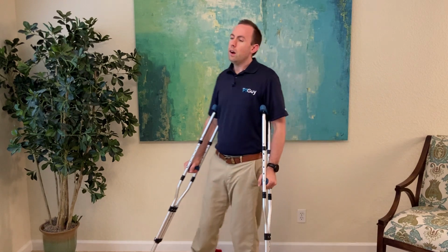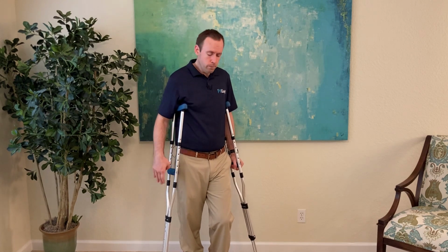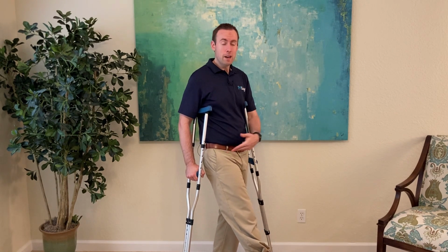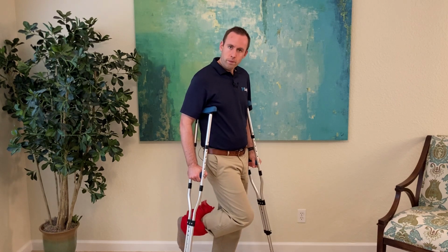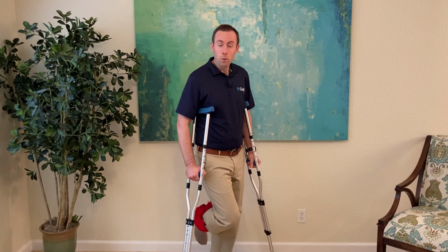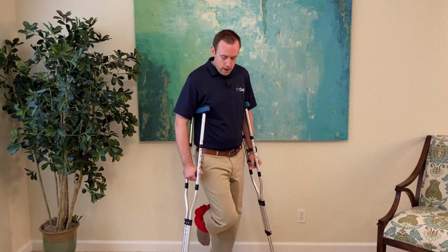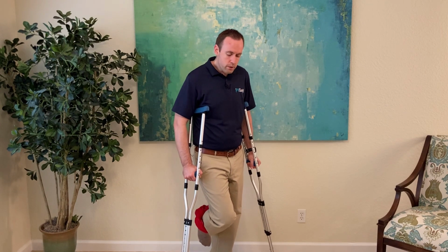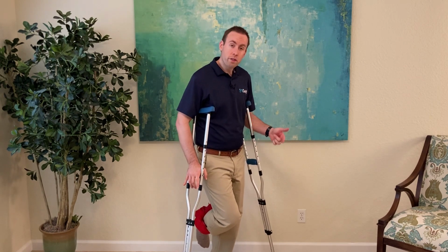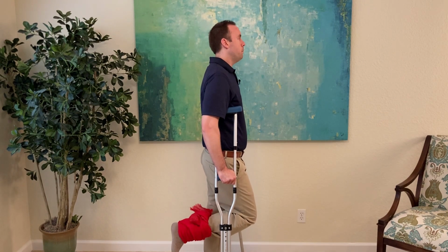If you don't have that issue and you can bend the knee, it's going to be way easier. And instead of holding your leg out again, because it's going to put a lot of pressure on your hip, do the flamingo. Okay, this is Florida, at least down here. This is what I teach people all the time with broken ankles and all sorts of ankle reconstructions and everything else, and they need to get from point A to point B using crutches. We're going to use this technique with the flamingo stance. Notice on the side, I look kind of like a flamingo here, okay?